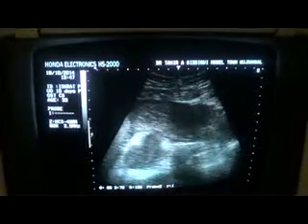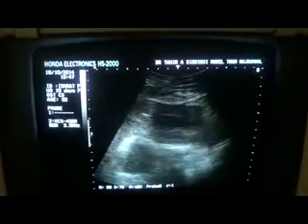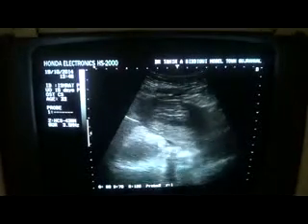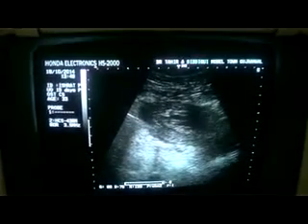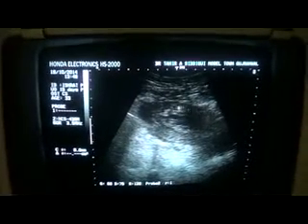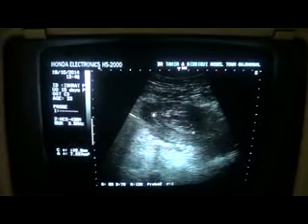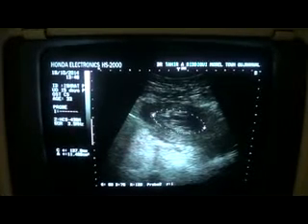What we are seeing is, first of all, let's evaluate the uterus, and you see that the uterus shows a dilated endometrial canal with multiple layers in it. Here we see this is the fundus of the uterus, and this is the anterior myometrium, posterior myometrium, and this area in the center is representative of the endometrial canal.